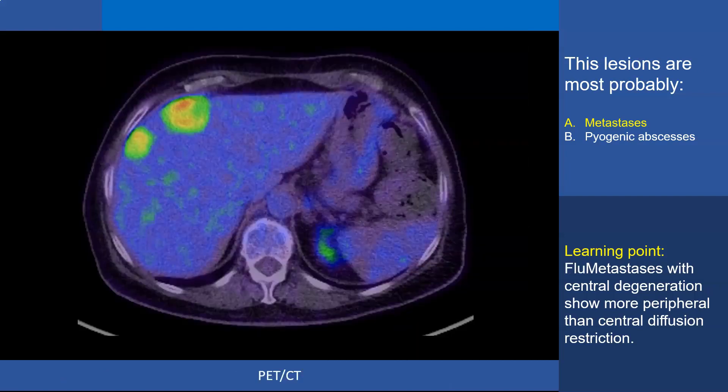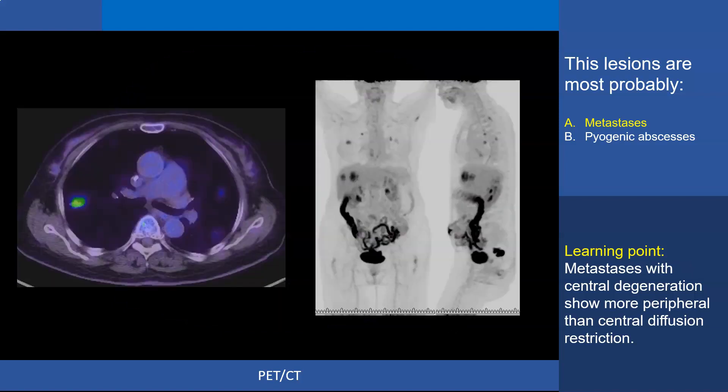On PET-CT, we see hypermetabolic FDG uptake in the whole lesions, not only at the periphery, which tells us that the central part does not contain fluid but contains tumor tissue with a certain degree of degeneration. The patient also has lung metastasis.